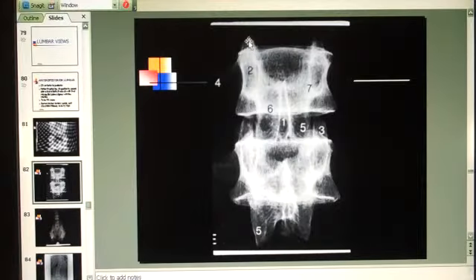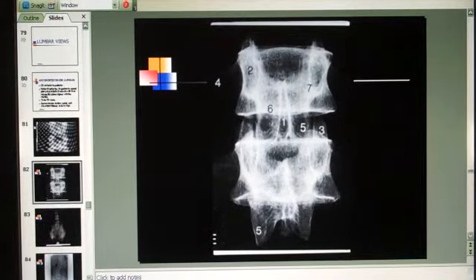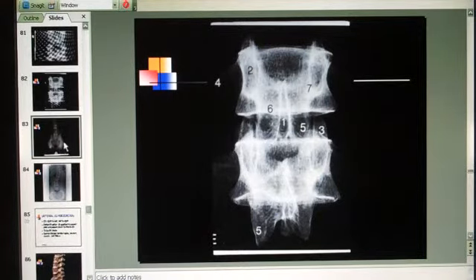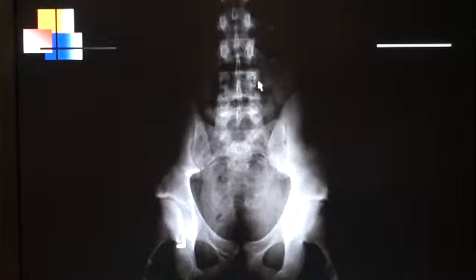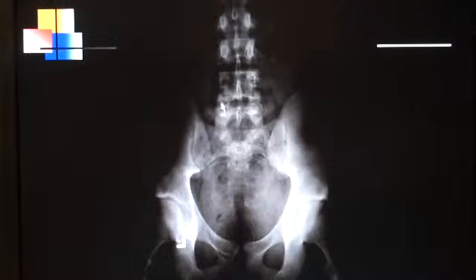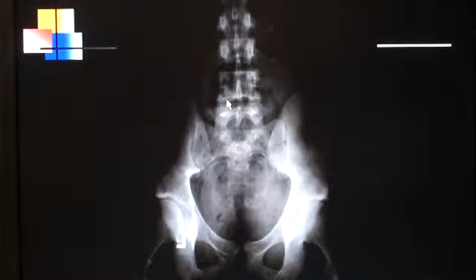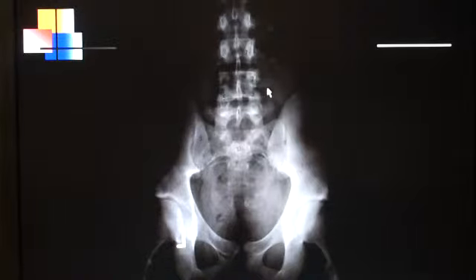Moving to another film now. Number one again is the spinous process. Number two is on the pedicle. Number three, the superior articular process comes up right here, and the joint space is right there. You can see the joint space on both sides — on one side is the superior articular process and on the other is the inferior articular process. Number four is on the transverse process, but again they don't have a lot of density so they're not showing up very well.